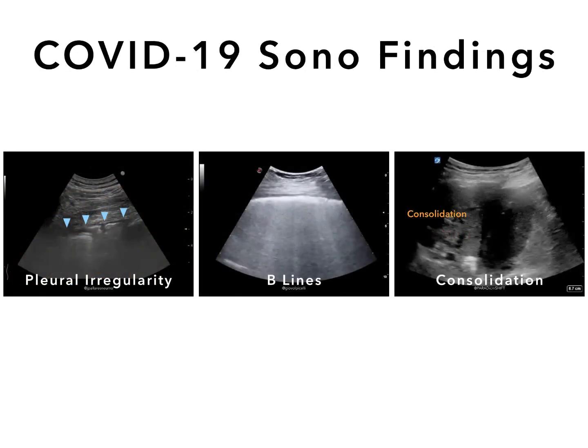We reviewed common sonographic findings of COVID, which include pleural irregularity and thickening, subpleural consolidations, B lines in a variety of different patterns from focal to multifocal to confluent, and frank consolidation. Remember that pathology is most commonly found posteriorly and inferiorly, and large pleural effusions are rare in COVID.